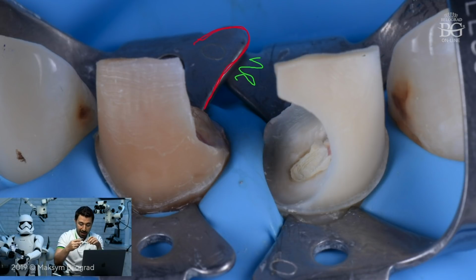And what is also funny is that I'm really against these wings, because these wings are not okay in case you need to place a matrix with a ring to do some composite restoration, for example. But in that case, this wing was super helpful. And you can see that the isolation was achieved by this wing.